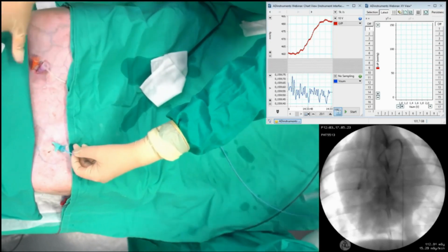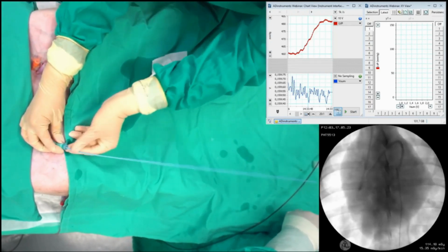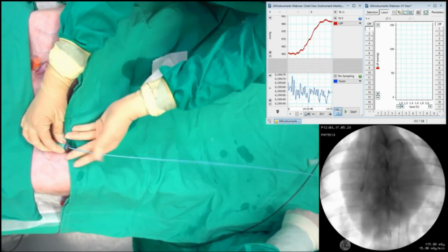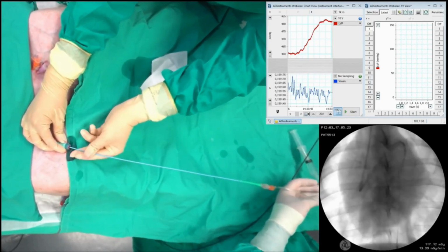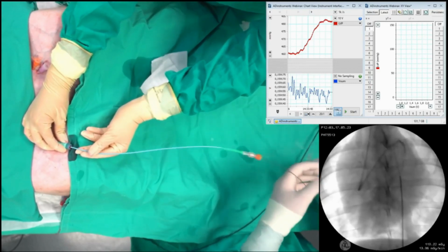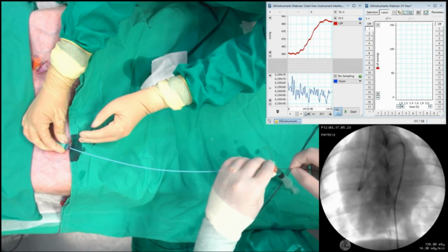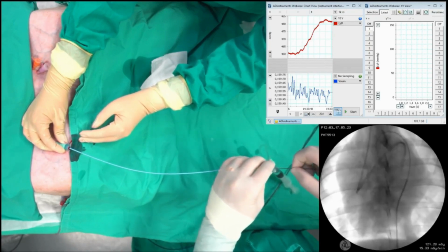And you see the guide wire coming up the descending aorta. Then we fix the guide wire in place, and we advance the angiographic catheter all the way up to the heart, which you will see in a second. And you see that the Swan-Ganz is already in place there. Then the angiographic catheter should show up in a second. There it is. And as you see, it has a very shallow curve that we can use to rotate the catheter and force the guide wire to be pointed toward the specific place in order to make it go around the aortic arch and into the left ventricle.